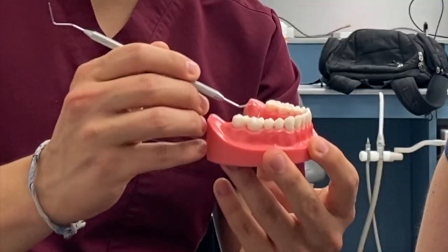Hello guys, I'm Octavia Garcia. I'm Rodrigo Guerrero. Today we're going to be doing a number 30 molar crown prep and we're going to be doing a bench stop so you guys get a better idea of what we're doing. We're going to run through some of the rules that you guys are going to have to follow for your PA.